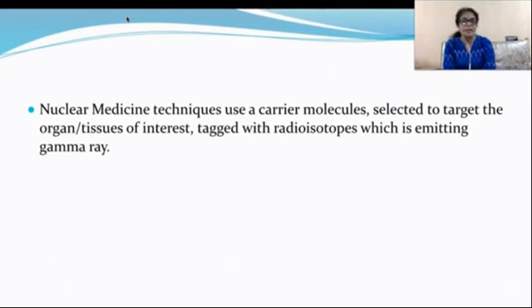Nuclear medicine techniques use a carrier molecule selected to target the organ and tissues of interest, tagged with a radioisotope which is emitting gamma rays.